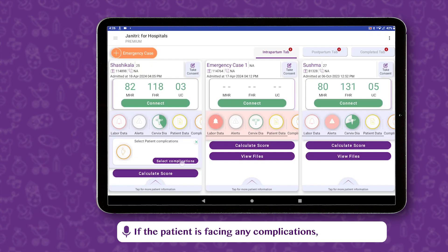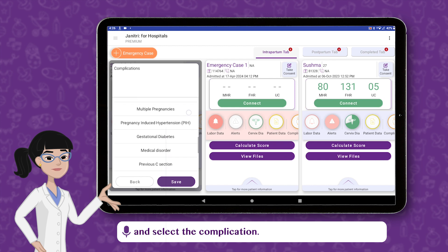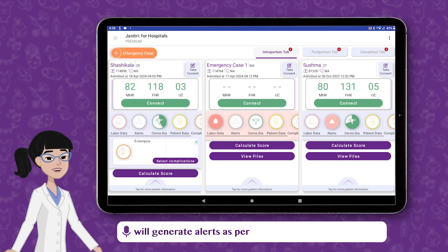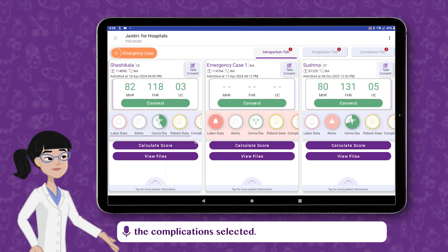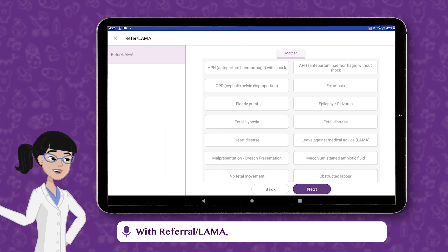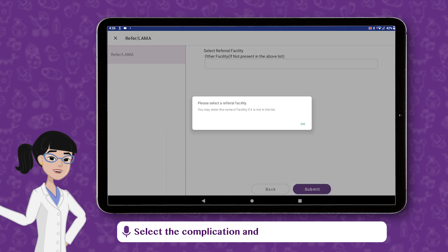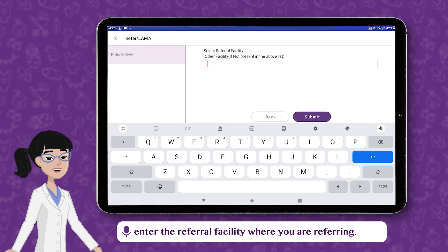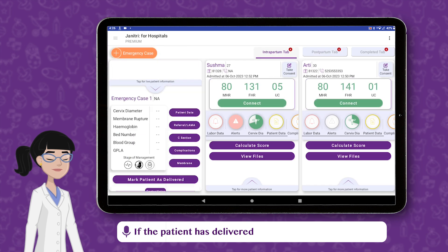If the patient is facing any complications, go to the Complications icon and select the complication. The software will generate alerts as per the complications selected. Go to Tap for More Information. With Referral/Lama, you can refer the patient to another hospital, select the complication, and enter the referral facility where you are referring.